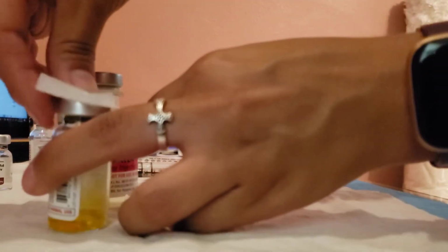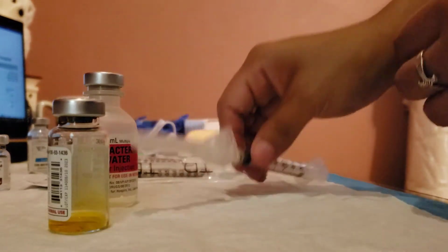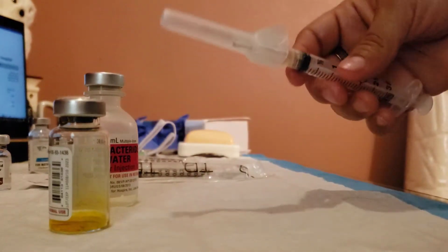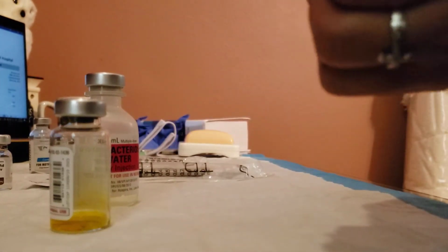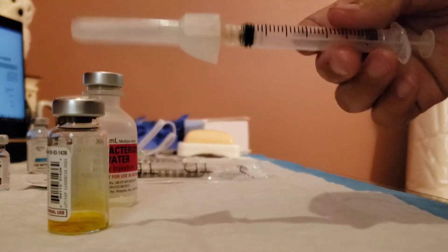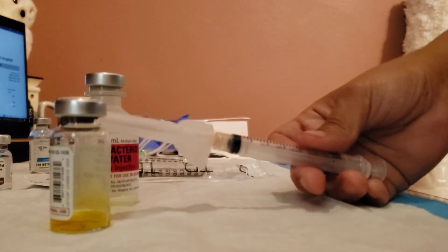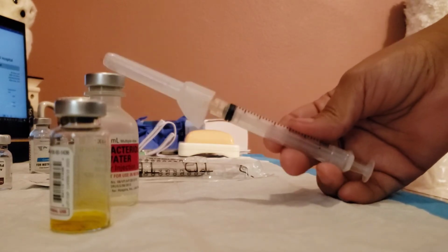So I'm going to pop my vials off. I'm going to clean and clean. I'm preparing this in my patient's room so that I don't have to label my needles and syringes, but I would label them if I was in the med room or anywhere away from my patient's room. So I'm going to go ahead and draw my 2.5 of my sterile water.